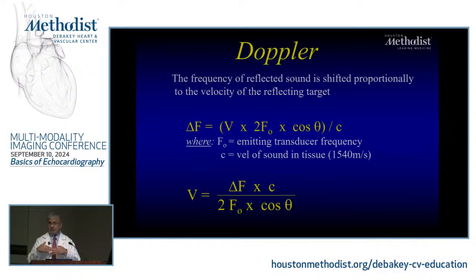And we usually, most of the time, don't adjust for angulation because flow is a 3D vector. You see the 2D portion, unless you're really very comfortable with where the flow is going, you probably should not. And we adjust our transducer position till we get aligned inherently that the velocity is highest. Take an example, aortic stenosis, right? You use the apical, you use subcostal, suprasternal, right parasternal, all of these, and you pick the highest one, which tells you I'm the least angulated, because there is no way for you to be able to see the direction of the jet. Got it?